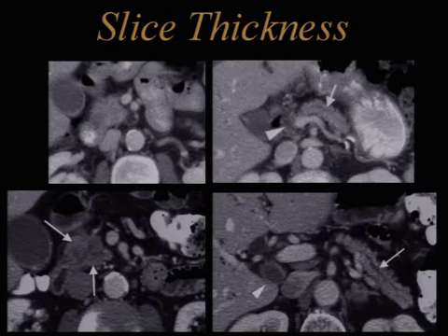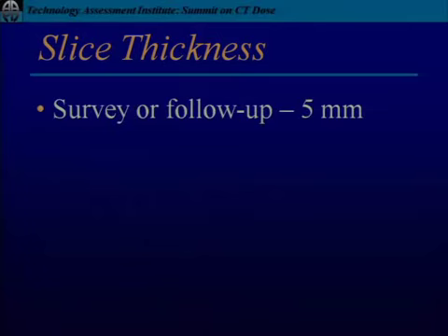Okay, so this patient was able to undergo resection because I scanned with thinner slices and more dose. Okay, so this patient benefited from more dose and thinner slices. So just to give you a launch-off point, this will differ between institutions and radiologists. I'm just throwing out what we use.